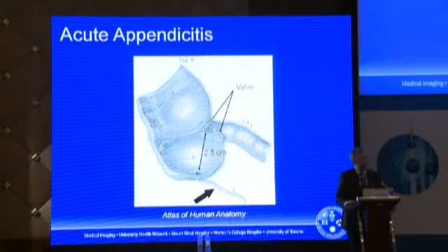The ileocecal valve we recognize because it is a valve. Dr. Mann alluded to it earlier when she reduced the intussusception. Remember, she spoke about the valve sticking into the cecum. So the appendix doesn't do that. The ileum does. There's a valve. So you can recognize the ileocecal valve with ultrasound.